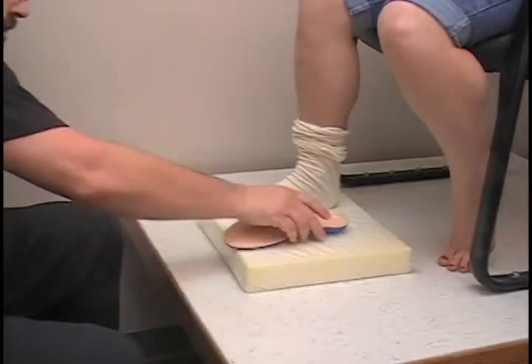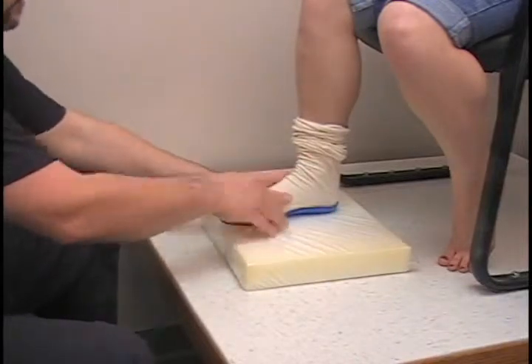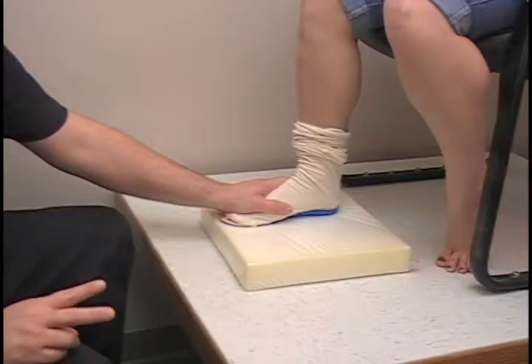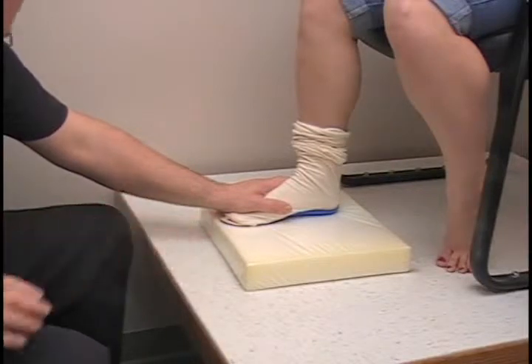Alright, you immediately place that on the patient's foot, centered real nicely, and then just have them lightly push down on it. It takes approximately two minutes for these to cool off, so while this one's cooling I'm going to heat up the next one.